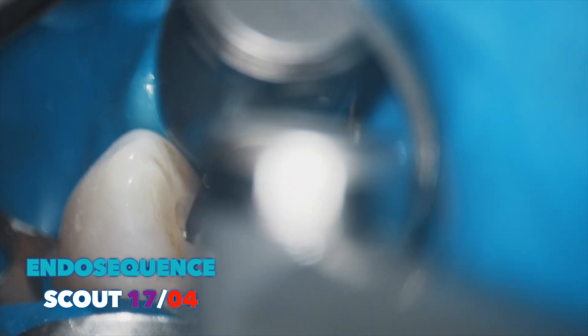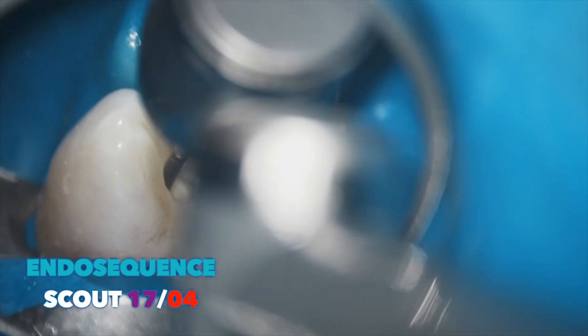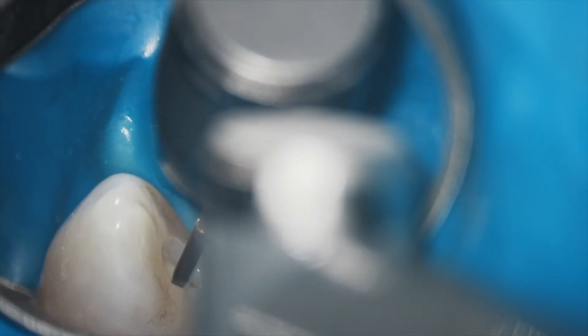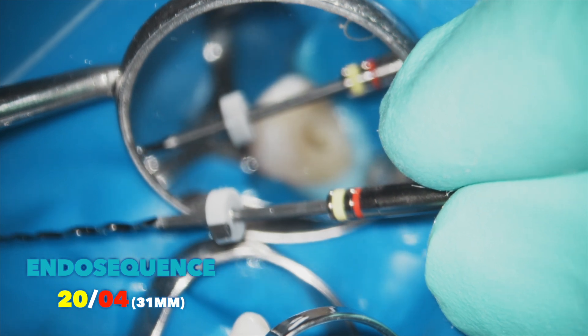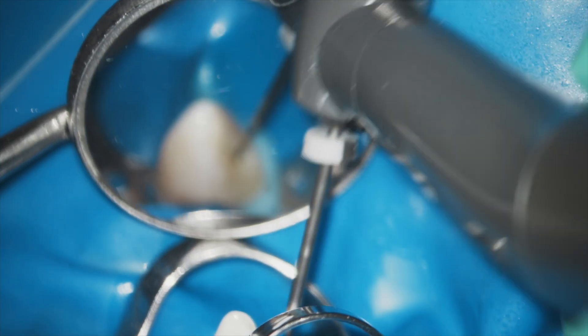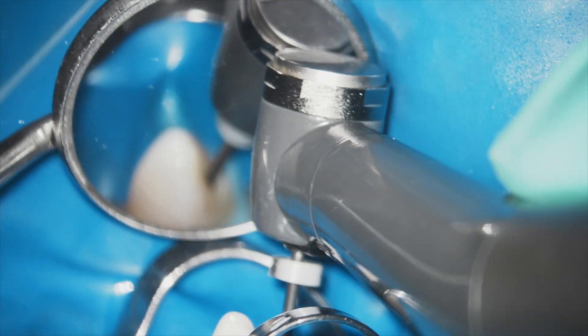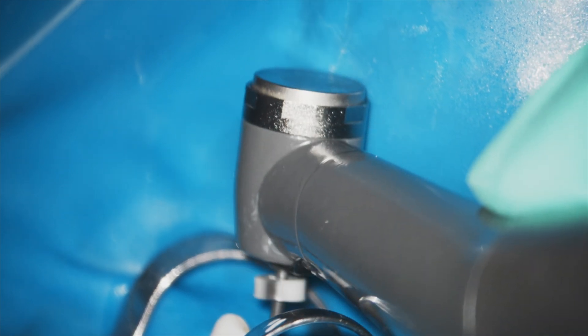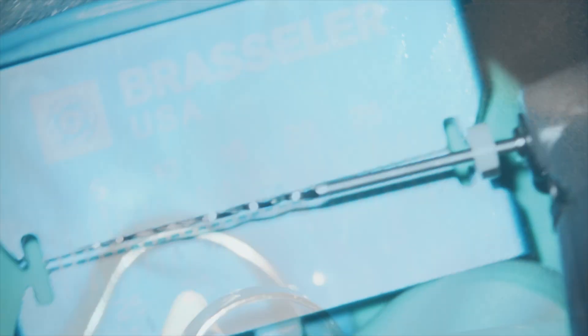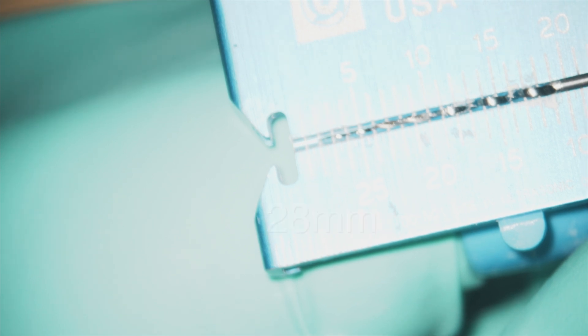I'm using the scout 17/04 to work my way down into this space, being very careful to remove just a little bit at a time. Now I'm moving to the 20/04, the 31-millimeter EndoSequence files. Using EndoSync Plus connected with the apex locator, the 20/04 goes all the way down to the end. This is a very long canal, so the 31-millimeter length is necessary. What I like about the conventional EndoSequence 28-millimeter files is that they are austenitic, so the cutting efficiency is tremendous.